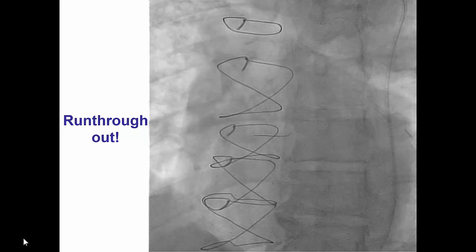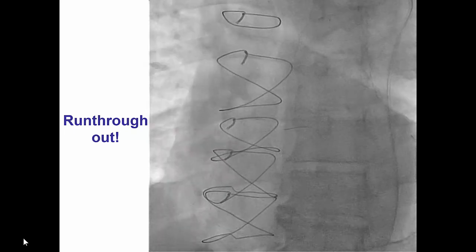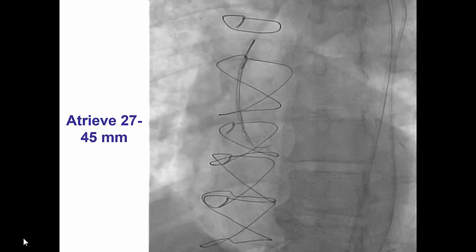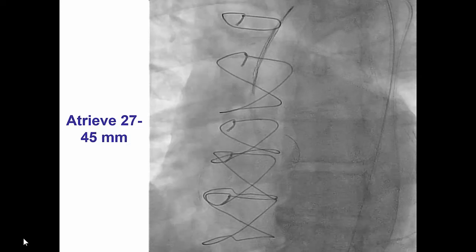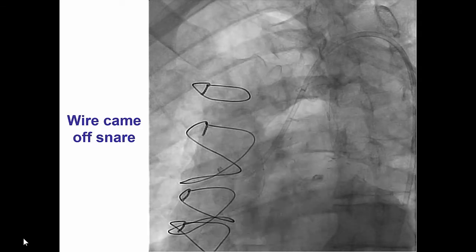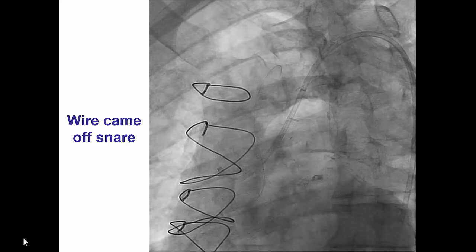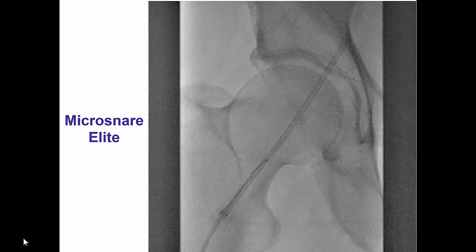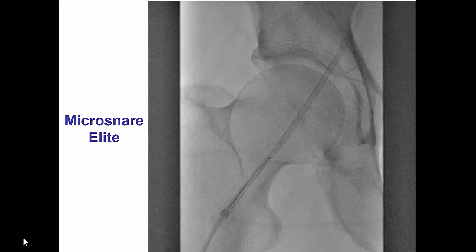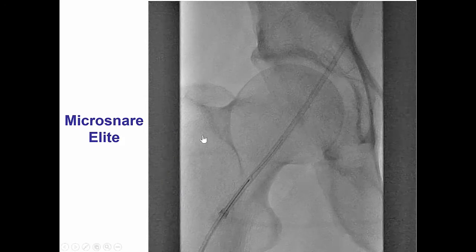The guidewire was snared using a 27 by 45 millimeter EN Snare. However, unfortunately, the wire came off the snare, and that happened within the guide catheter. So we had the wire still halfway in the guide catheter but could not pull it all the way back.